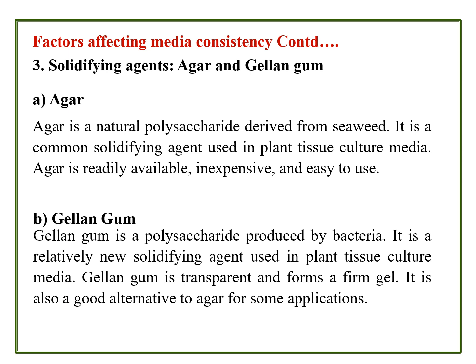Without agar, the plant tissue culture medium can also be prepared. That medium is known as suspension medium. So the absence of agar gives the suspension medium, and with agar is the solid agarized medium. Next, gellan gum. Gellan gum is a polysaccharide produced by bacteria.